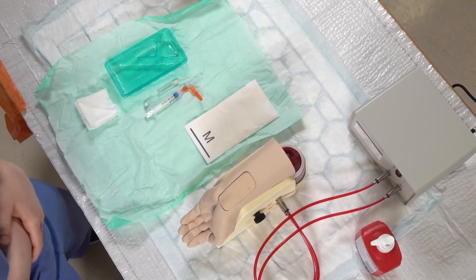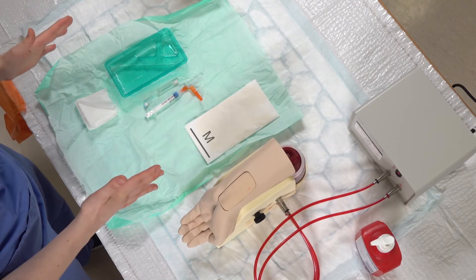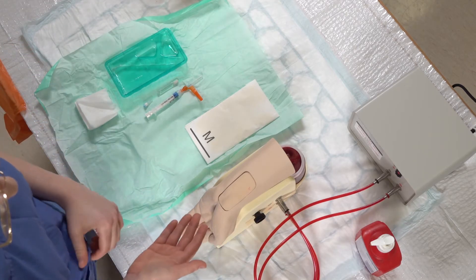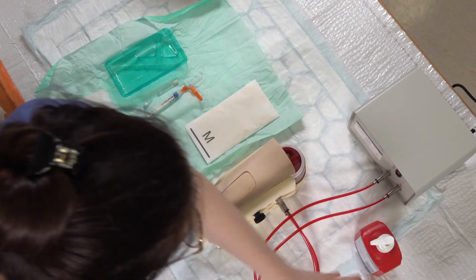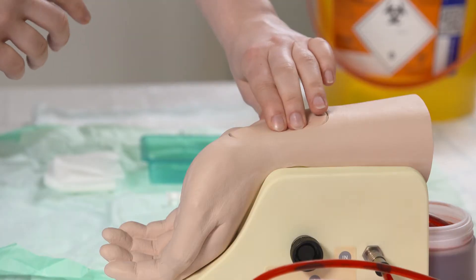Hello, today I'm going to do an arterial blood gas sample. I've got my pre-prepared trays ready set up. I've got my patient's arm and some alcohol gel. I'm going to wash my hands first with the alcohol gel and then palpate for the radial artery.